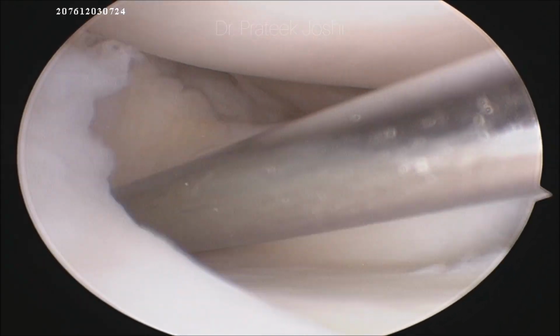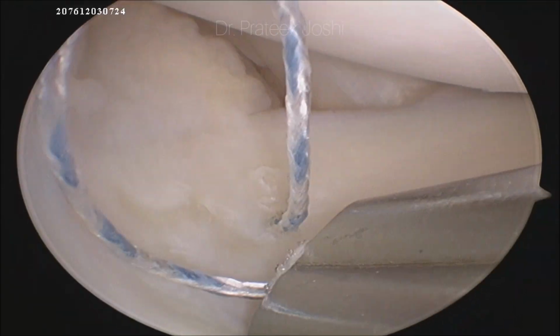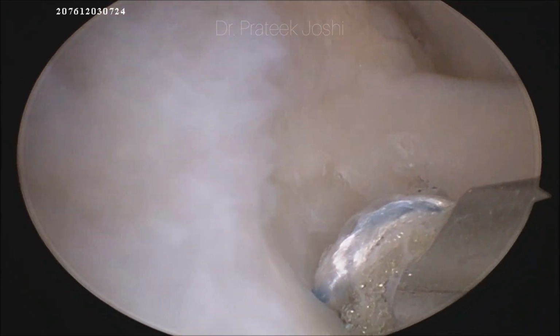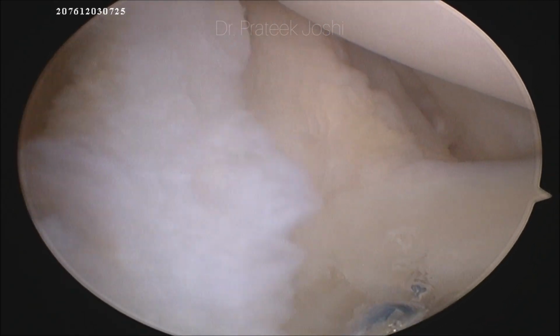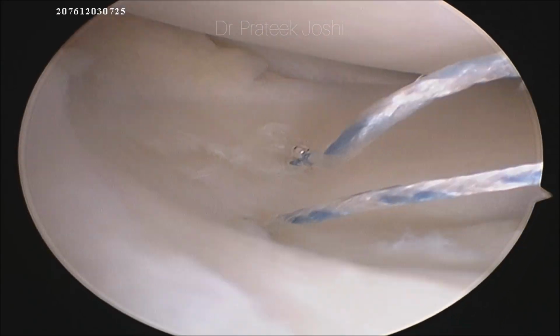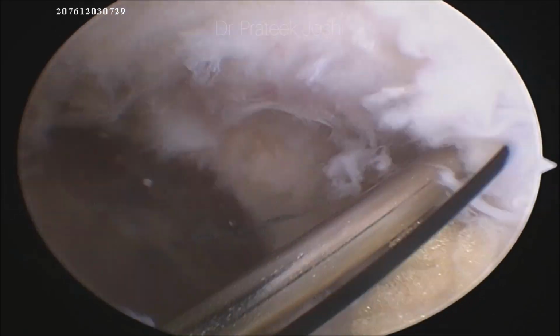And now I am going to use inside out device for the stitch which we are going to pass through the body portion of the lateral meniscus. So as you can see, I have introduced the cannula for inside out suture device, and I have passed the needle through the meniscus tissue. My assistant is going to pull out the needle from outside, and then I am going to introduce the cannula again and pass the second suture through the meniscus tissue.